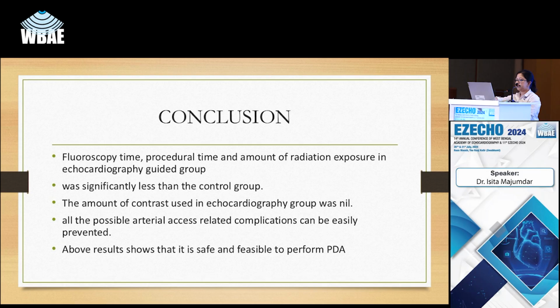So the conclusion from that: fluoroscopy time was very less, and procedural time was minimal because only venous access was done. Even in small patients it was very good, and in many patients nowadays we don't use any arterial access. The amount of radiation exposure was minimal, no contrast was used, and all the possible arterial access related complications were avoided.